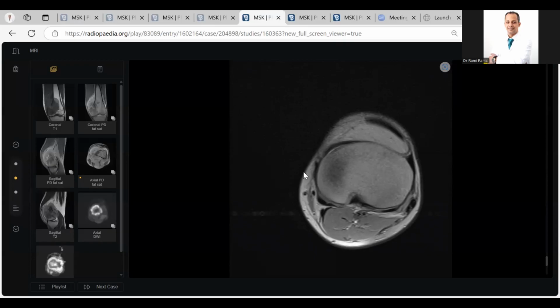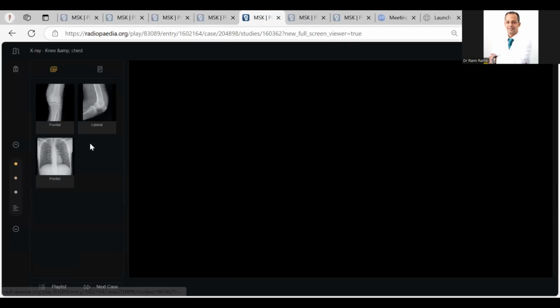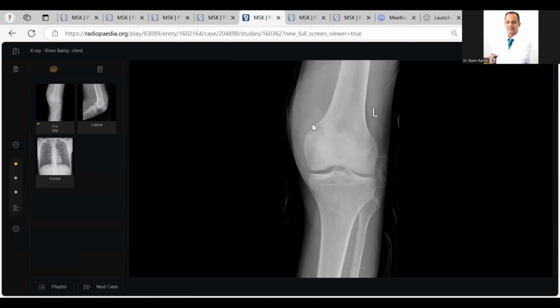First, especially in osteosarcoma, you will image the whole limb to rule out multifocal osteosarcoma. Second, staging CT. Third, bone scan. Then finally, you say I will transfer the patient to a special bone center for open surgical biopsy. Here you forgot to tell me there is sclerosis. You picked up the soft tissue.